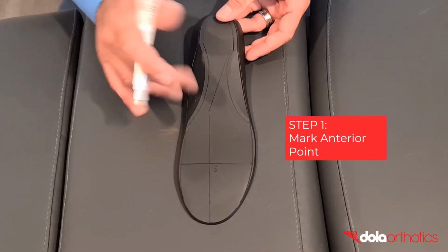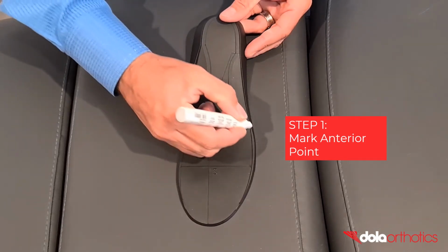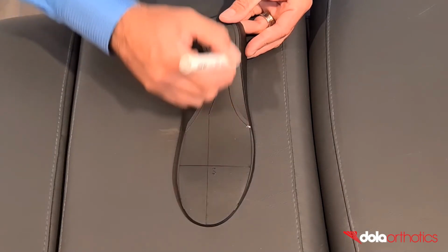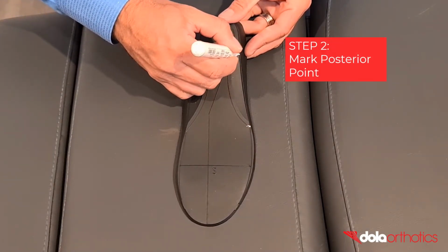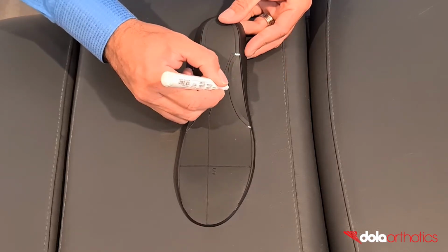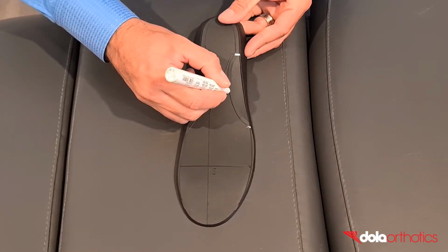Step 1. Mark the anterior or distal point of the grind. This will commonly be a point behind the 5th MPJ at the distal lateral arch. Step 2. Mark the posterior or proximal point of the grind. This is commonly at the point of the maximum heel cup width at the proximal lateral arch.